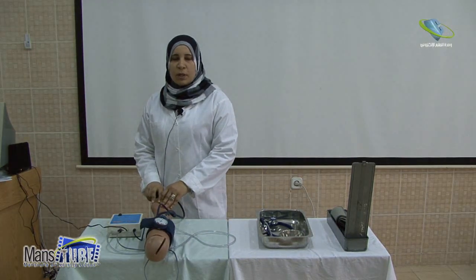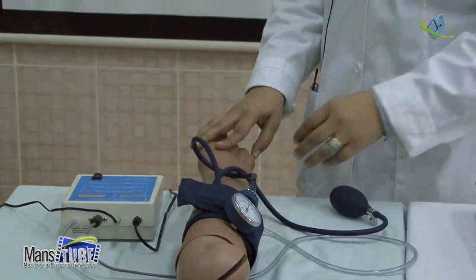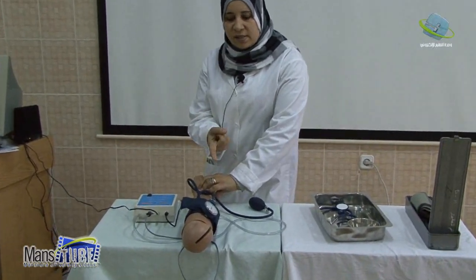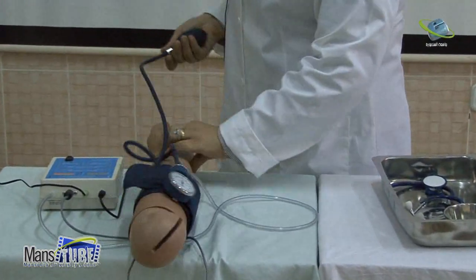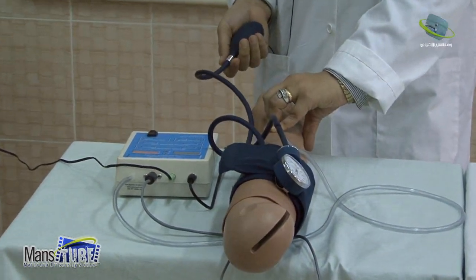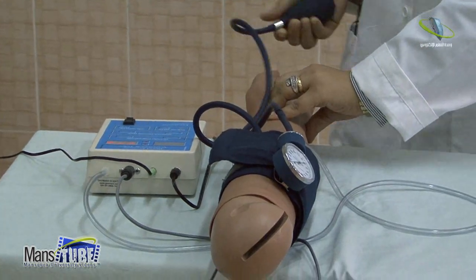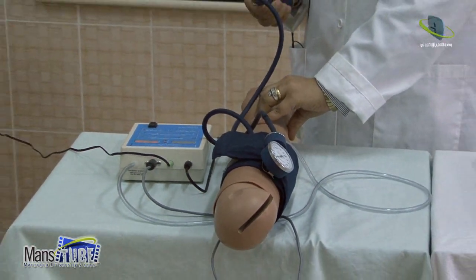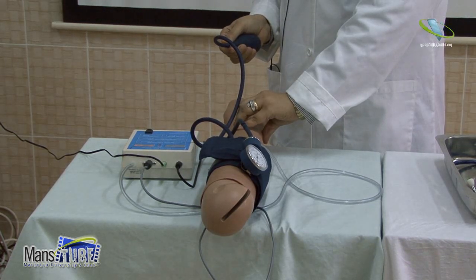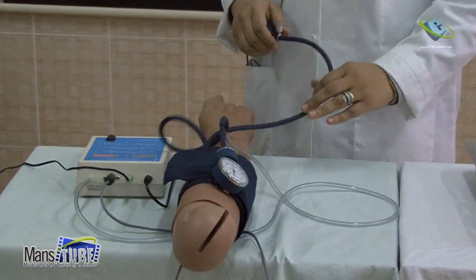We have two methods to measure blood pressure: the palpatory method and the auscultatory method. For the auscultatory method, we use a stethoscope. For the palpatory method, we use a finger to palpate the radial pulse. After palpating, we inflate the cuff until the pulse fades — this indicates the point at which we should raise the pressure 30 mmHg above. Then we open the valve slowly, deflate the cuff, and when the pulse returns, we indicate the systolic blood pressure.